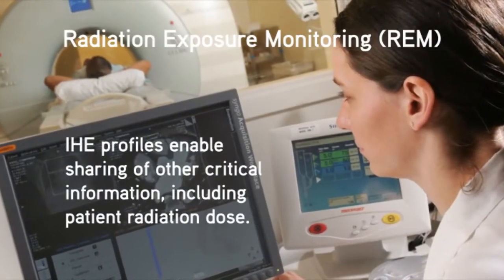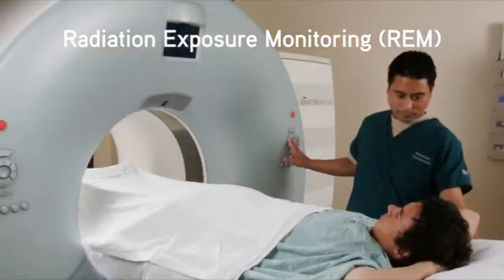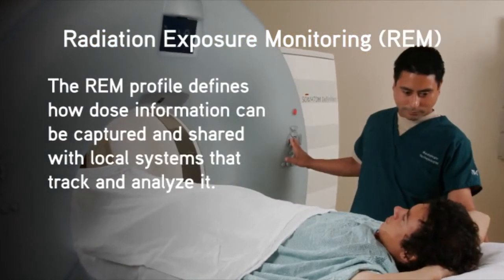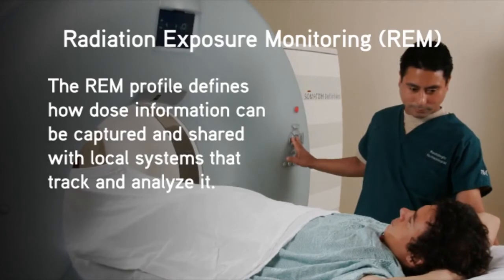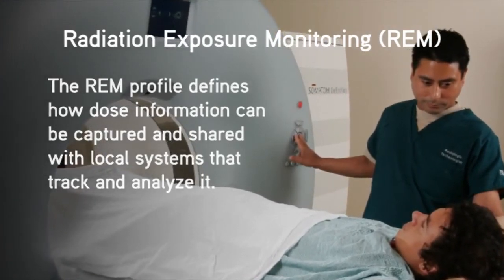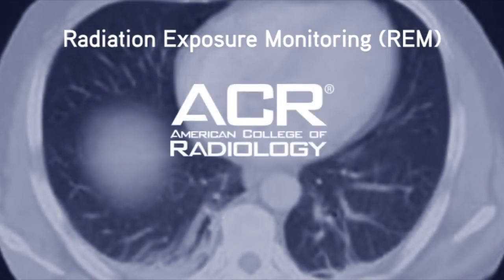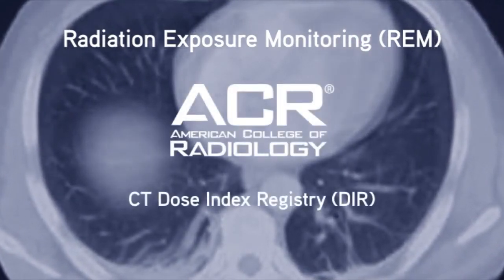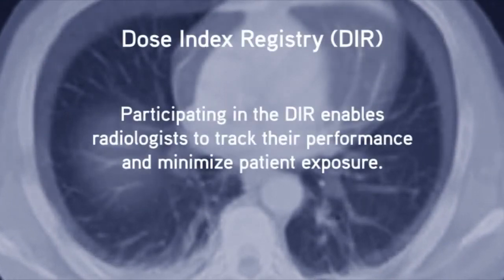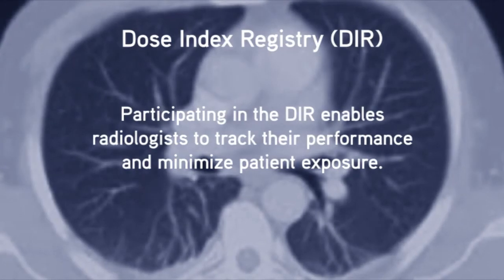IHE Profiles enables sharing of other critical information, including patient radiation dose. The Radiation Exposure Monitoring Profile defines how dose information can be captured and shared with local systems that track and analyze it, as well as broader databases like the American College of Radiology's CT Dose Index Registry. Participating in the DIR enables radiologists to track their performance and minimize patient exposure.